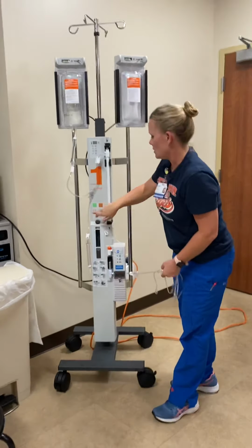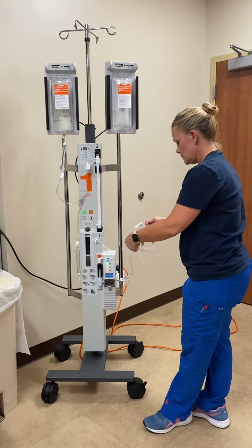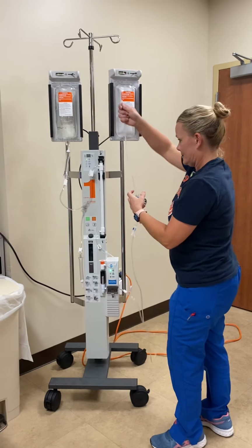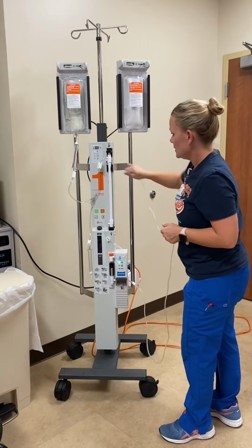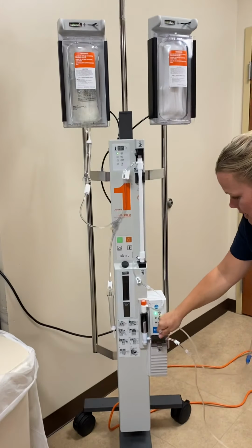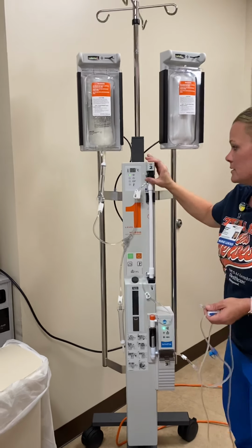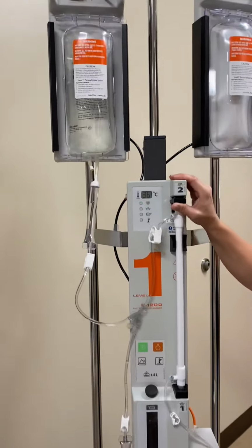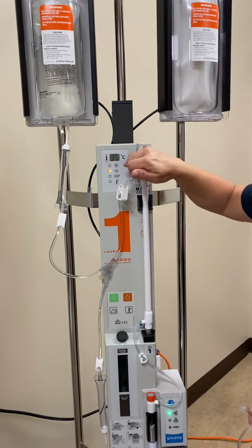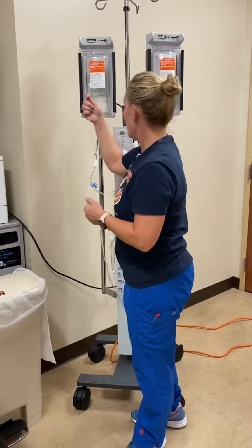Okay, so we're gonna go ahead and turn it on, just the big green button. It's gonna alarm at me too because I have it clamped, so I gotta hurry up and get it unclamped. So all systems go up here, it means it's running appropriately. All systems go right here, running appropriately. One of the biggest alarms you're gonna come across is this one, because I always forget to push this lever down. And it's gonna tell you, hey, you forgot to push your lever down. So I'm gonna open this up.